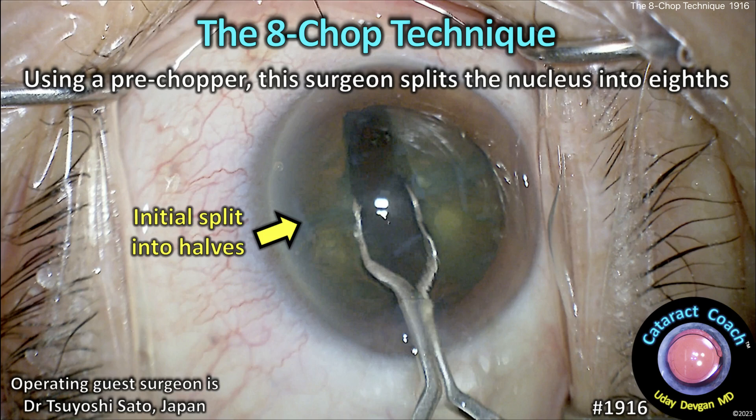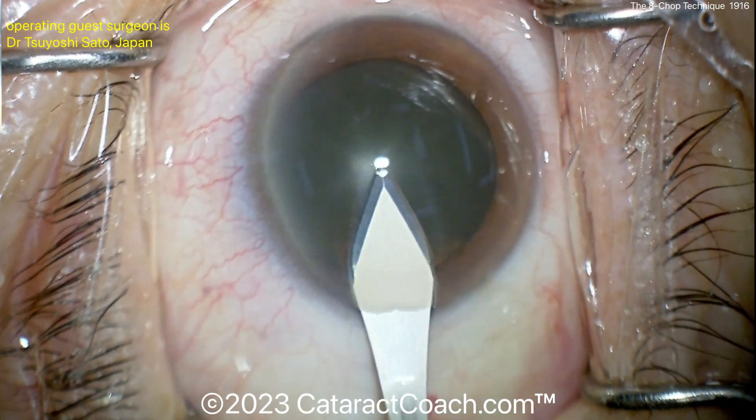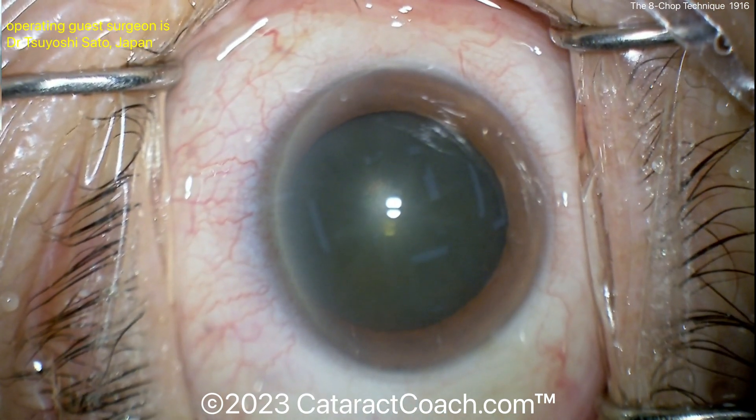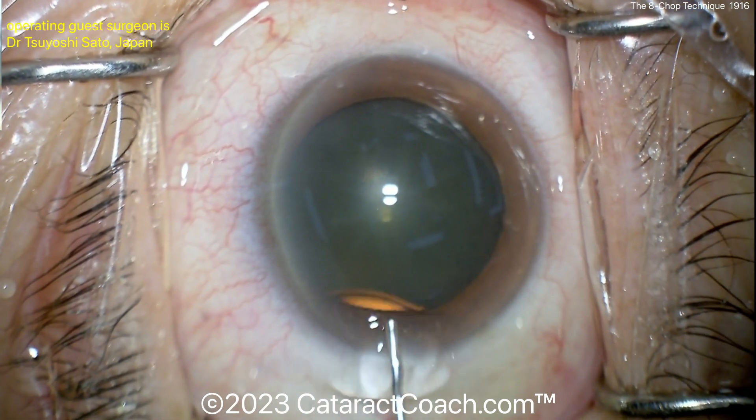CataractCoach.com presents the eight chop technique using a pre-chopper, where the surgeon splits the nucleus into eights. Starting off with good draping, the surgeon makes the incision without even fixating the eye.